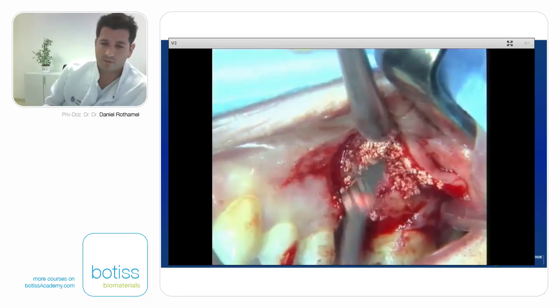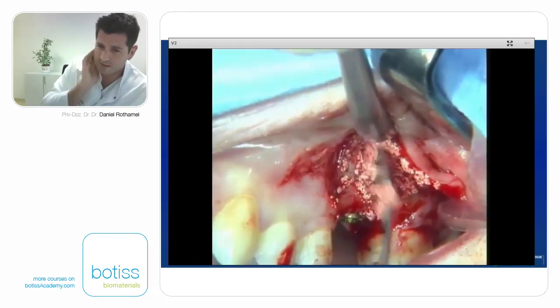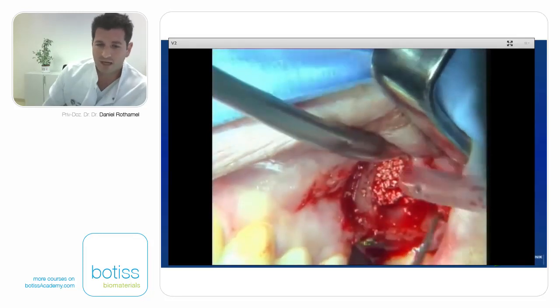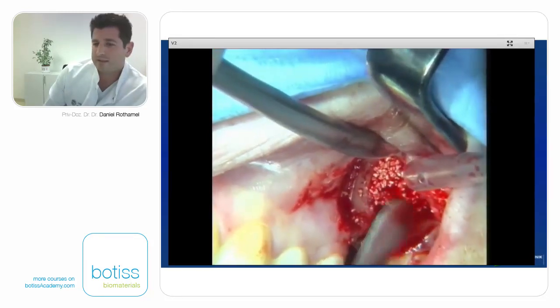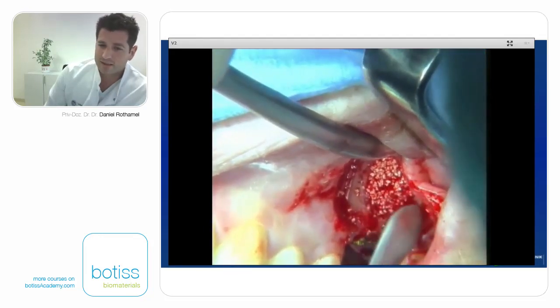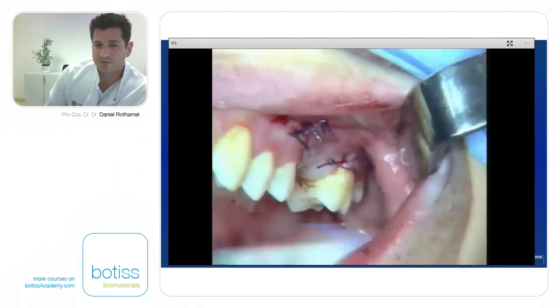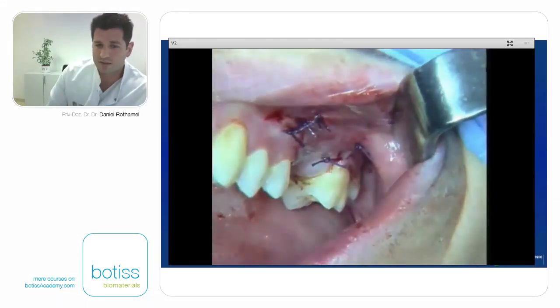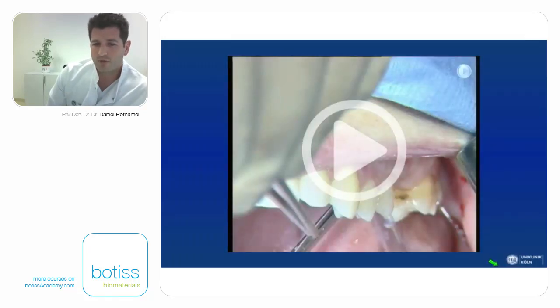Then, of course, this is an old case. There was a lot of discussion within the last years about placing an implant in this specific area. Of course, we didn't perform a periosteal incision, so therefore it was mentioned from different surgeons that there's no need for membrane application. We will see about the literature later that, of course, today we have to place a membrane even in this situation when we use some bone substitute material in direct contact to the mucoperiosteal flap.